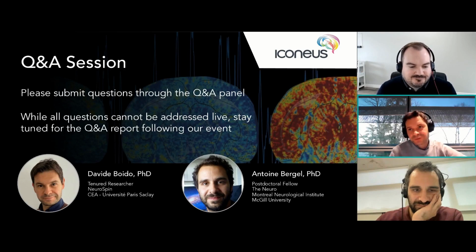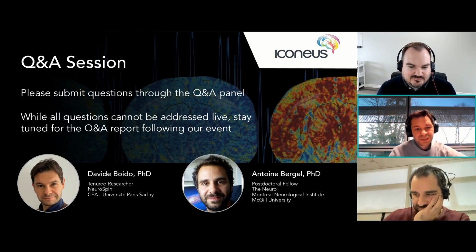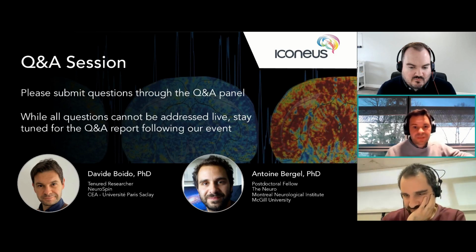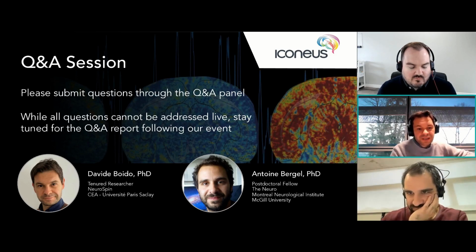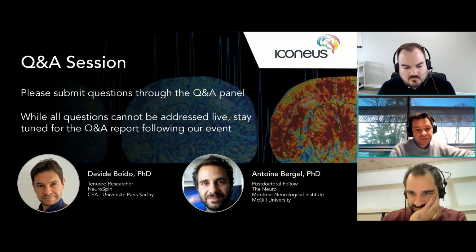And moreover, the PMP or TPX cover that is suitable for functional ultrasound, although it does not show any artifact for both fMRI, breaks the homogeneity all over the olfactory bulb, so it makes the shimming even trickier.